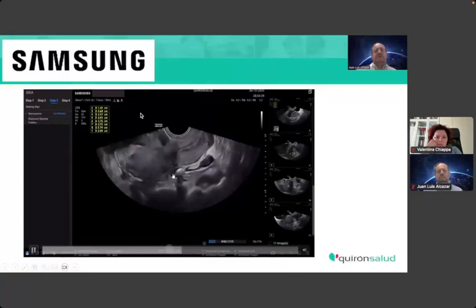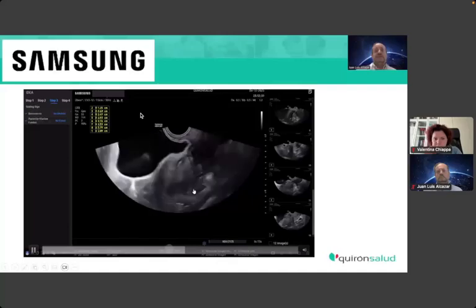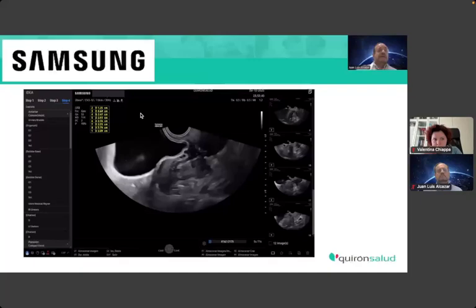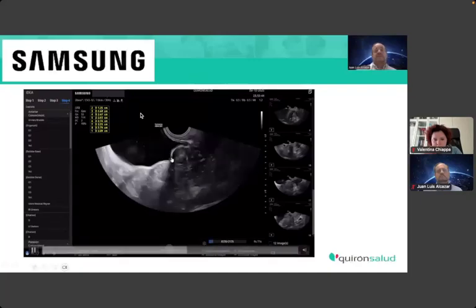And this a little bit sliding, you see, fixed. Sliding here positive, sliding here negative. So sliding sign negative.